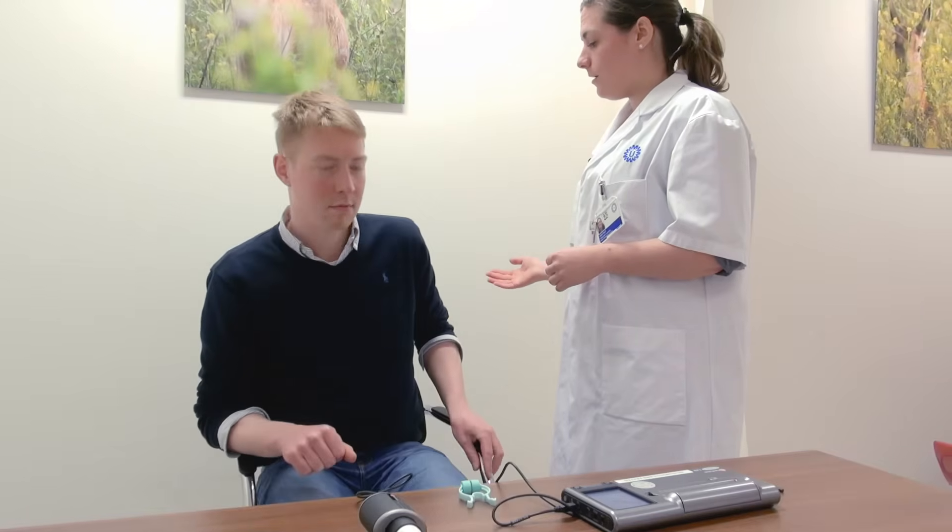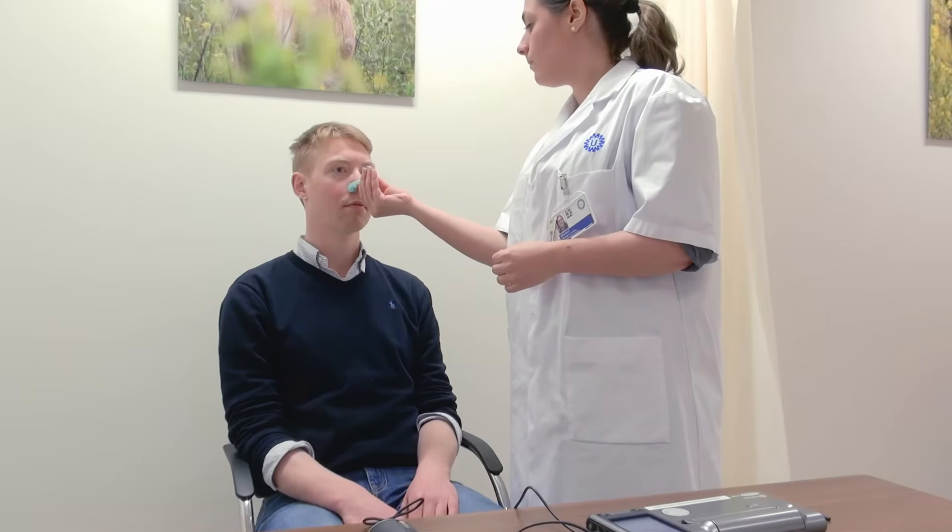You need to be sitting up straight with your back against the back of the chair. Your shoulders should be down and your eyes should be open. You want to have both of your feet on the floor with your legs together. I am going to give you this nose clip so that we can clip your nose closed. Is that comfortable? Yes. And can you breathe through your nose? No. Good.